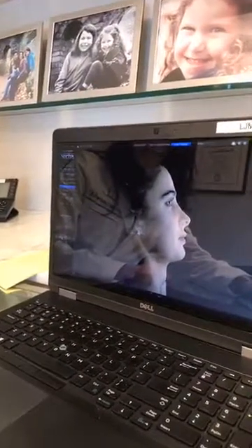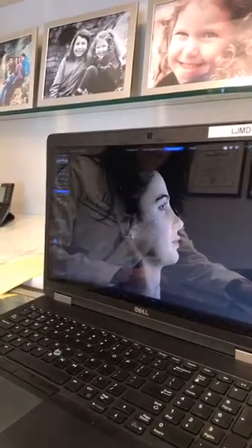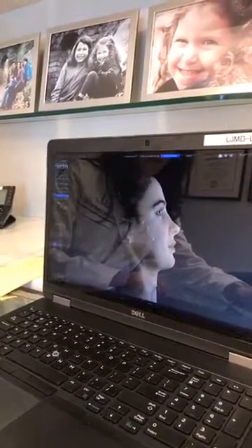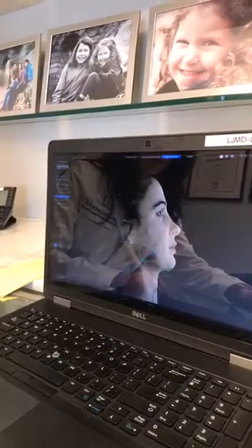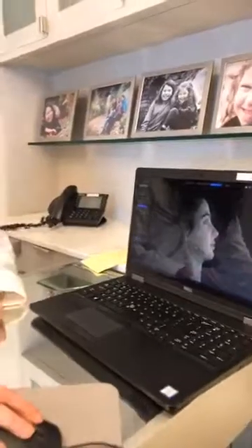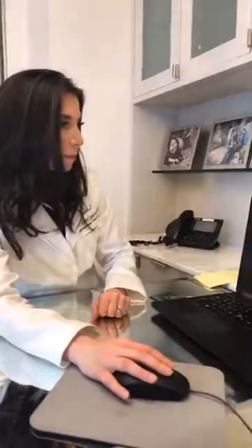So now we can go to this, and let's say if I wanted to lift her cheek, not that she needs to, but I can move tissue, or let's say if she were older and I wanted to move things along the jawline, then I can also lift that. Not that that's necessary for her, but it has a lot of other applications. So it's great.